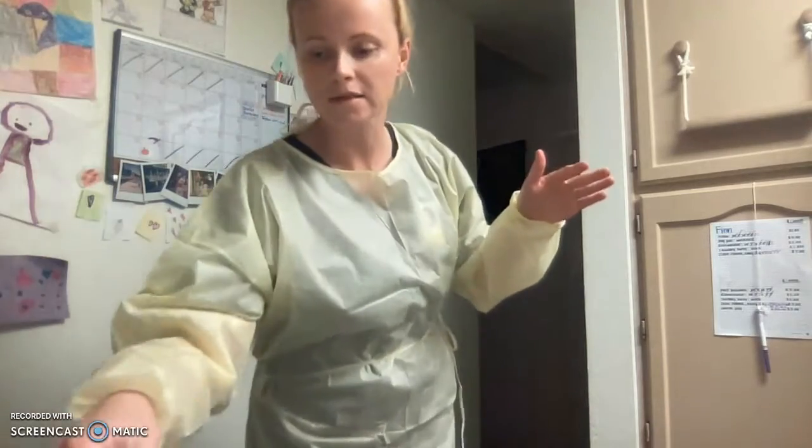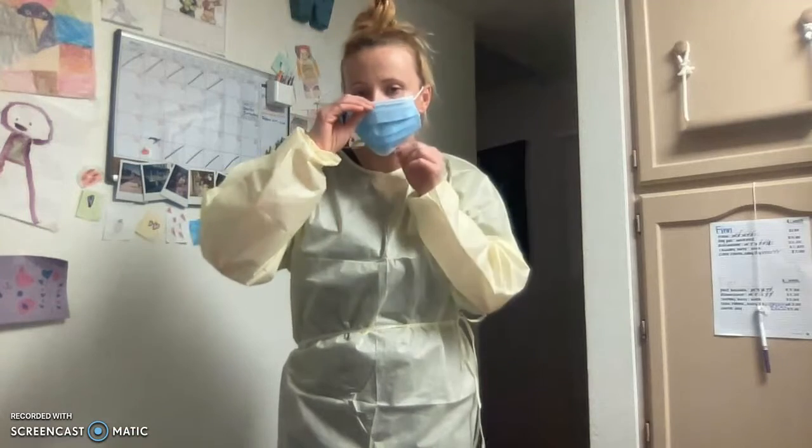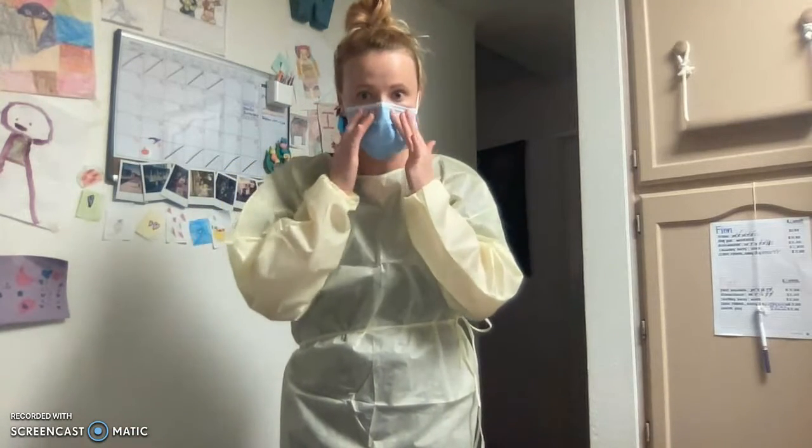Next, I will put on my mask. Open it up. There's a metal strip here — press it down to conform to the shape of my face.